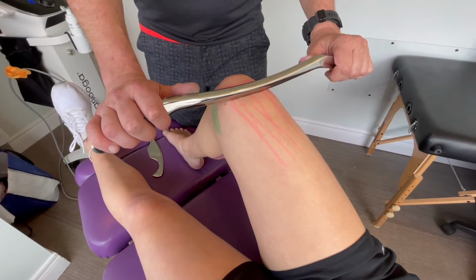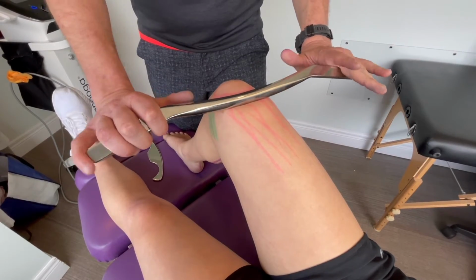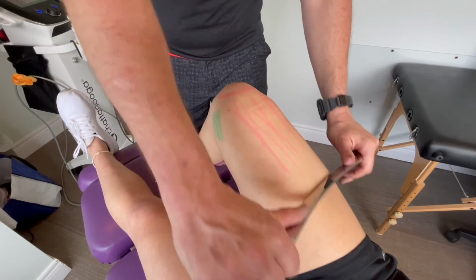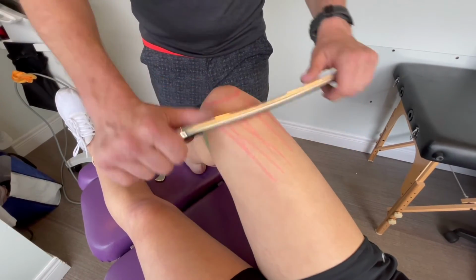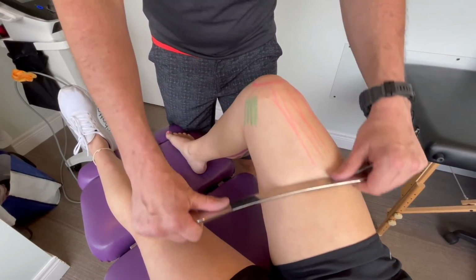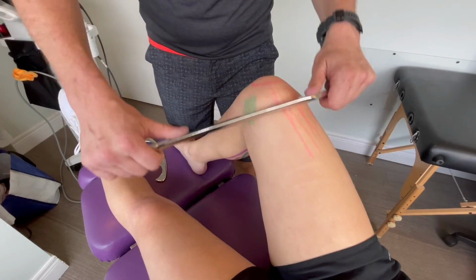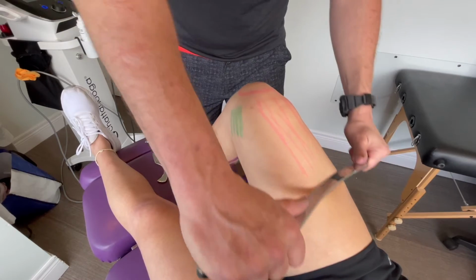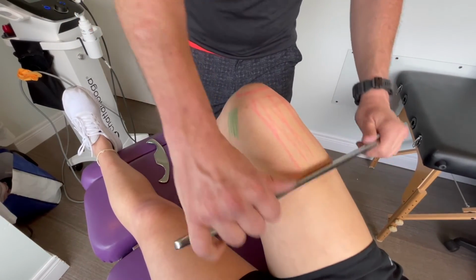The final thing we do for most knee complaints is a thing called Graston. These big handlebar tools rip apart some of the scar tissue and work on the nodules. This is going to be a little bit more painful than the Shockwave, but patients notice a difference. What I'm feeling for when I'm doing this is little nodules in the tissue, and then I really hit on those pretty hard. The quad's a little different than the other muscles.